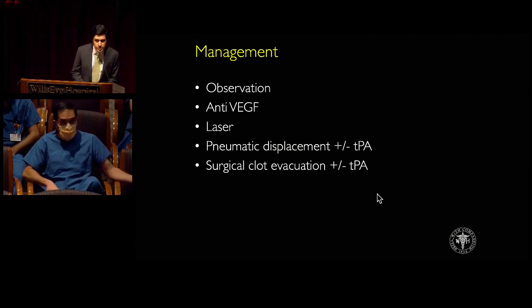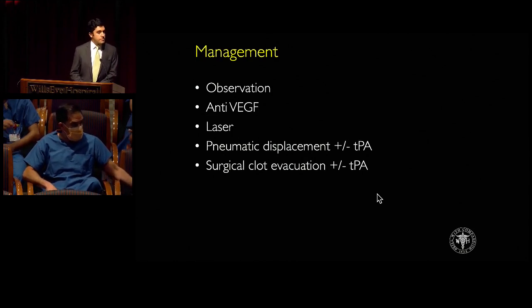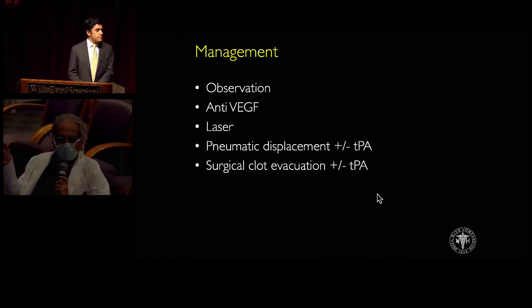Is there ever a concern for inducing an arterial occlusion? It's been reported, and actually, I know a colleague that did that. We modeled the flow through it, and it is very chaotic, and actually almost a low flow state usually.